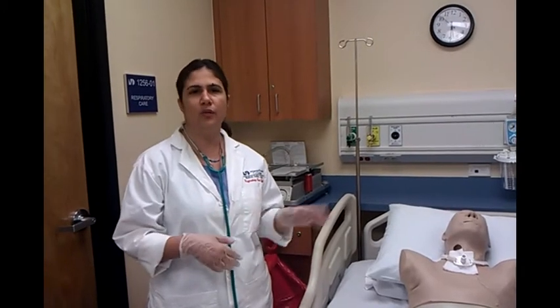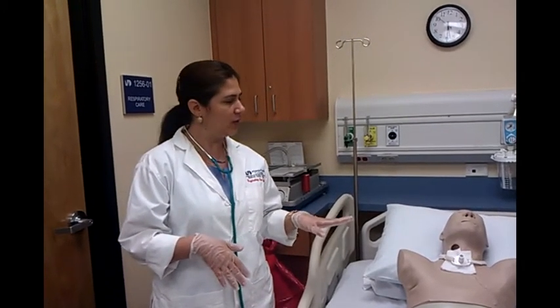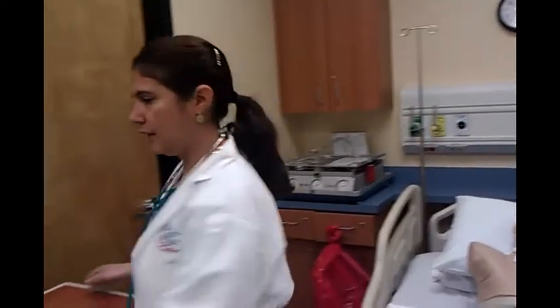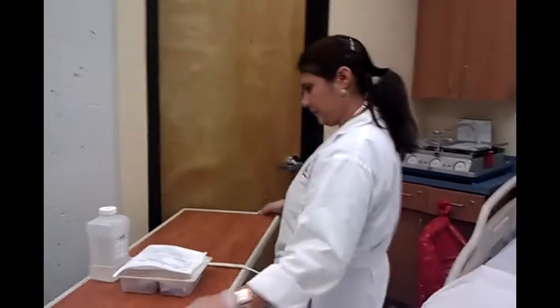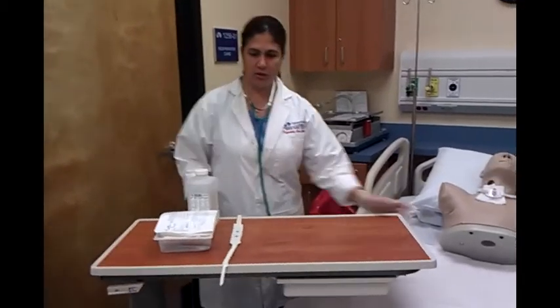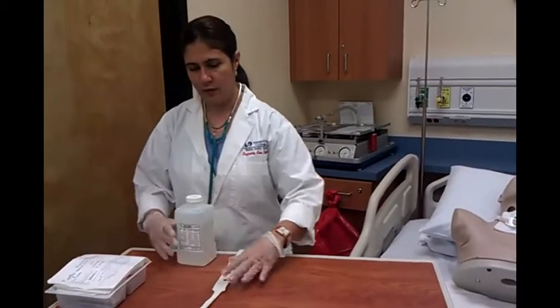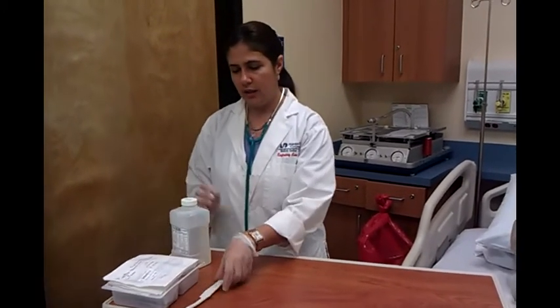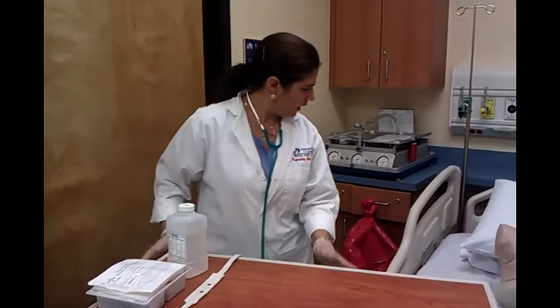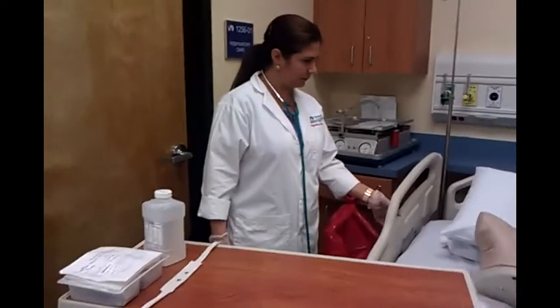My patient sounds clear. He doesn't have any mucus and secretion inside his lungs. I don't need to do any suction. Now I'm going to start doing the trachea care. I'm going to put the table close to me and the patient to have enough room to access all the equipment. I need to have the trachea care kit, the stoma tie, and sterile water. I'm going to put the bed in sitting position.